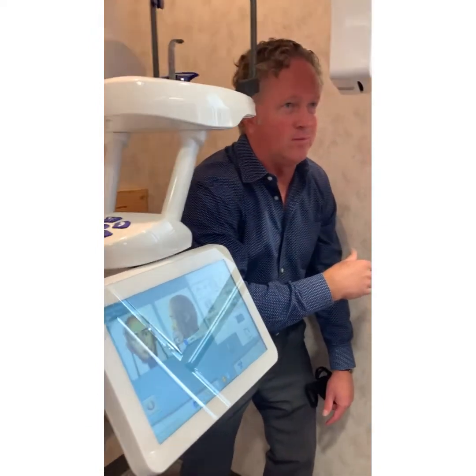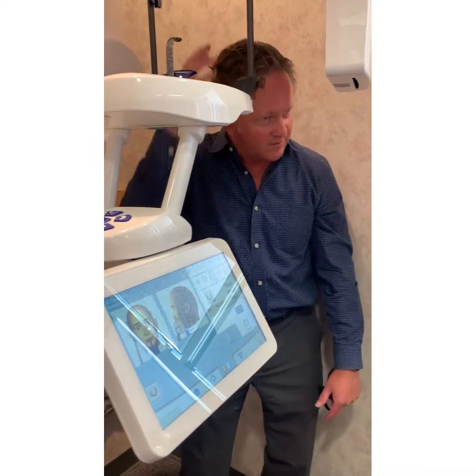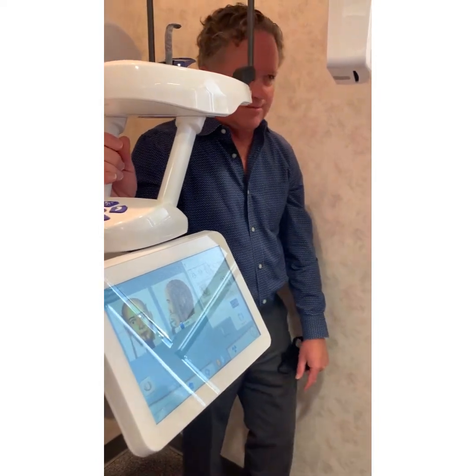But if I come up behind any of you and swat your ponytail, you're going to move, because it's just a natural human reaction. That's what ponytails do. When you have articles of clothing, big hair, clip-in hair, something. So what do you tell them to take down? I make them take the clip out. Actually, we'll get to the technology. I make them lower their ponytail. I mean, if they have a beehive, you could just pop this off.